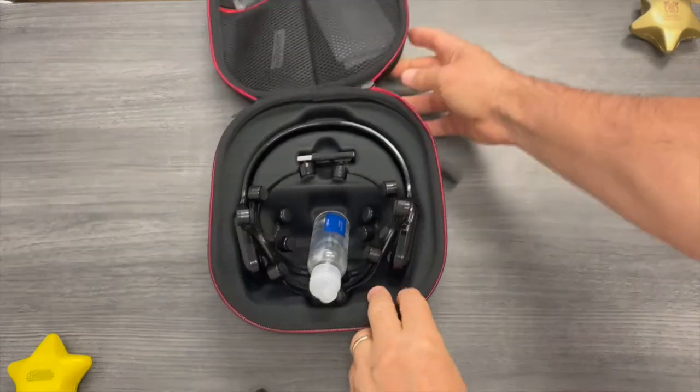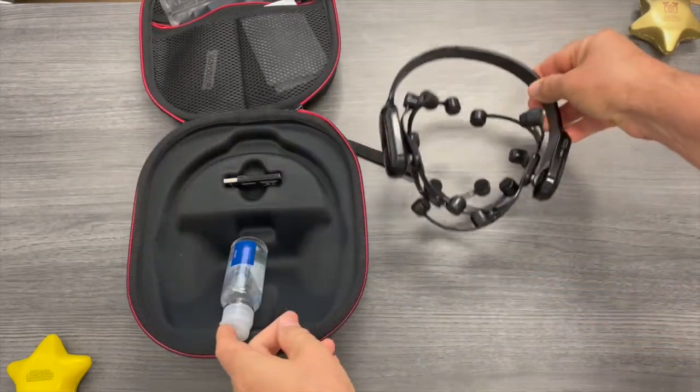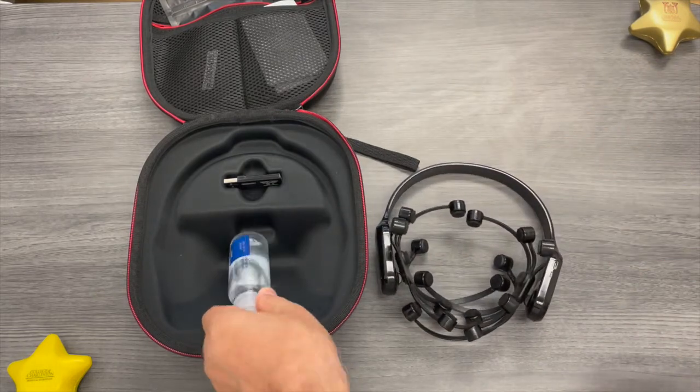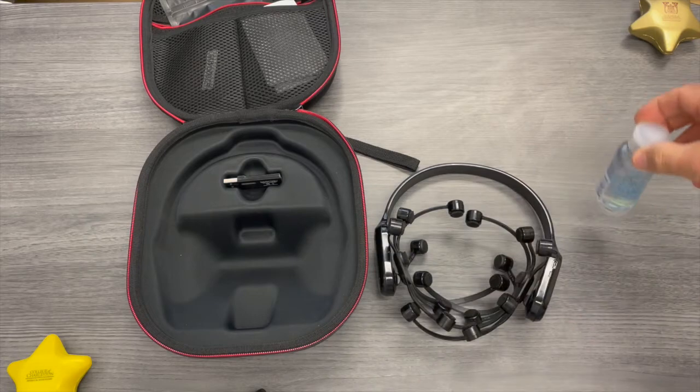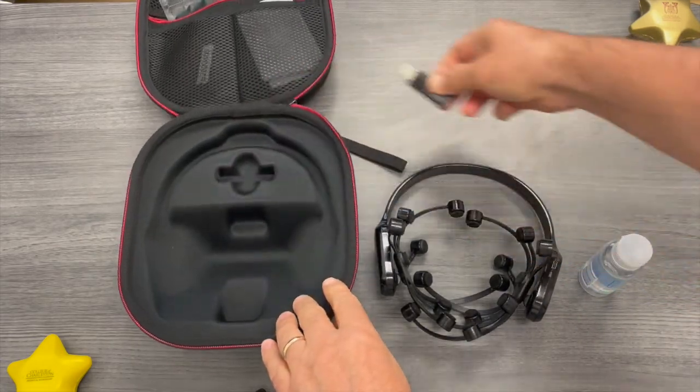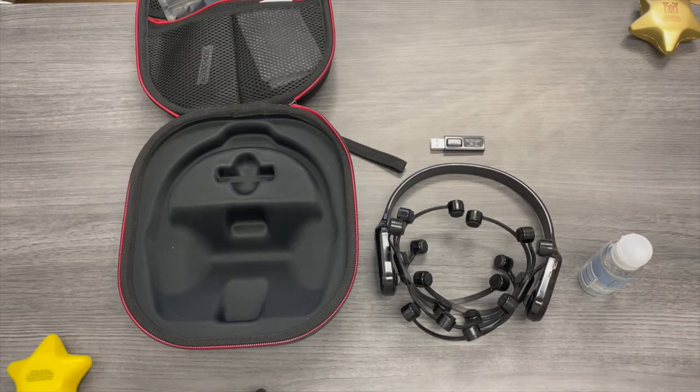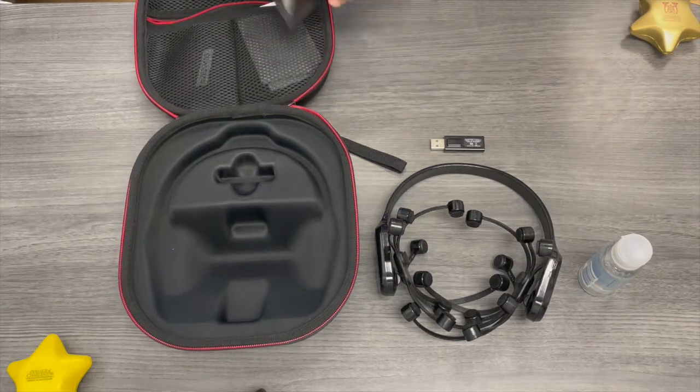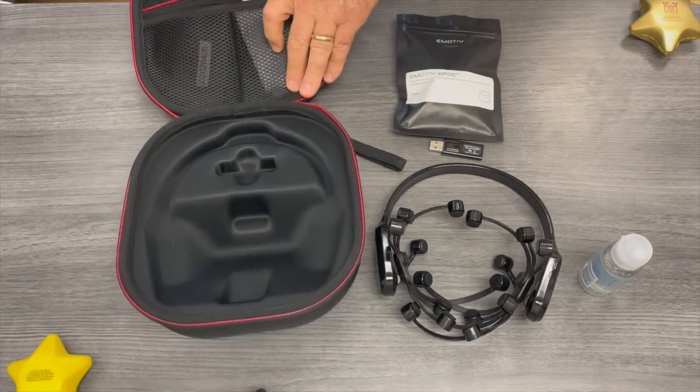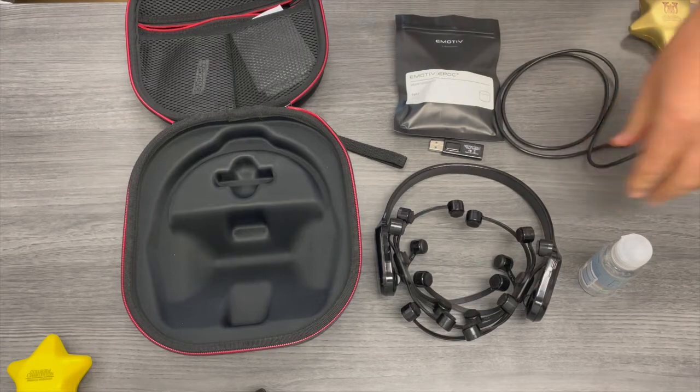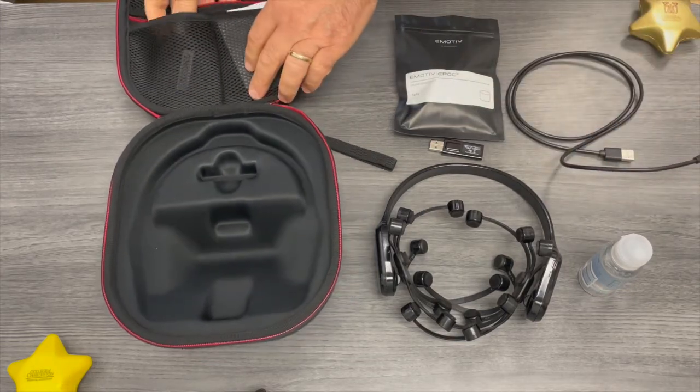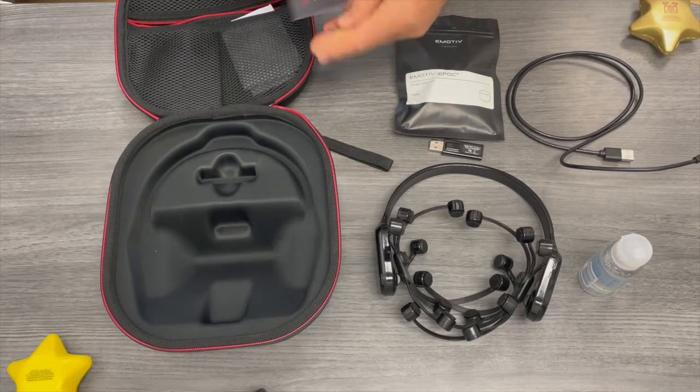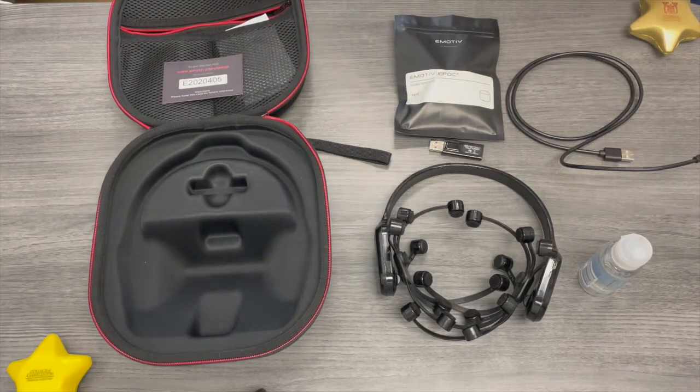Your unit is coming with the USB dongle as you see it with the saline solution, and also you'll get the felt pads that actually go in the electrodes to make a good contact with the skin.